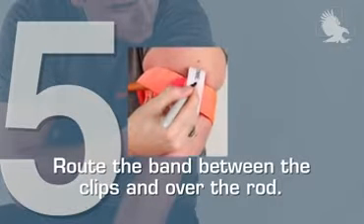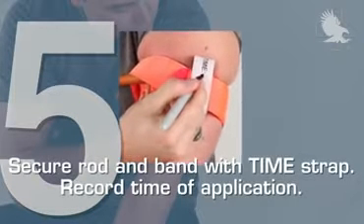Step 5. Route the band between the clips and over the rod. Secure the rod and band with the time strap. Record the time of application.